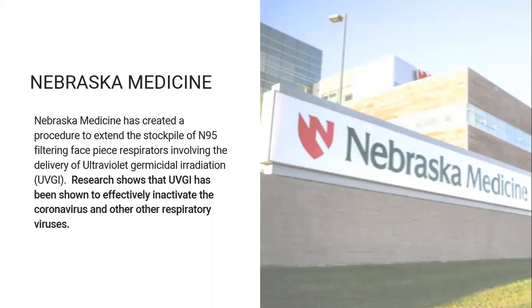Nebraska Medicine created a procedure to extend the stockpile of N95 filtering facepiece respirators involving the delivery of ultraviolet germicidal irradiation, UVGI. Their research shows that UVGI has been shown to effectively inactivate the coronavirus, COVID-19, and other respiratory viruses.